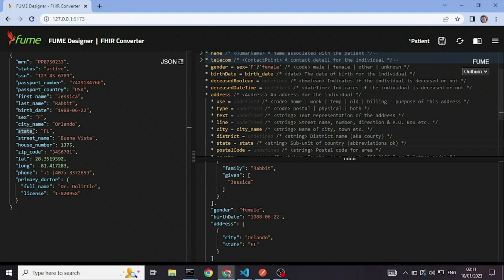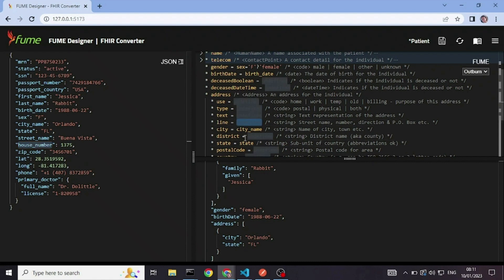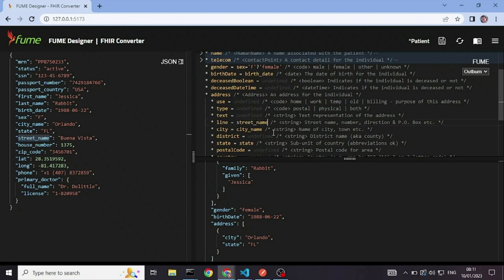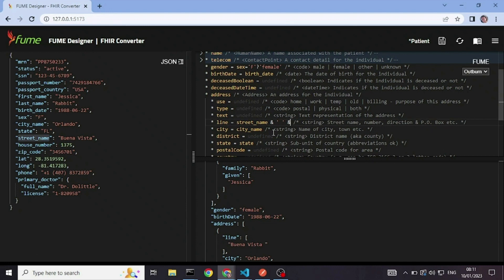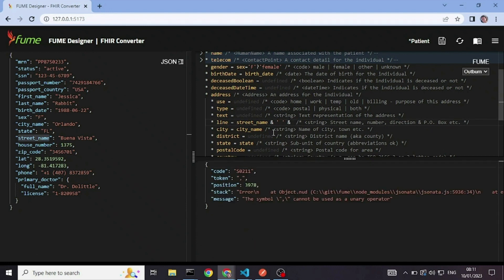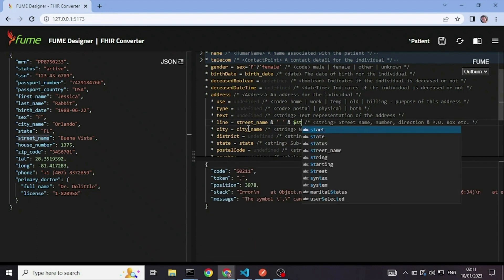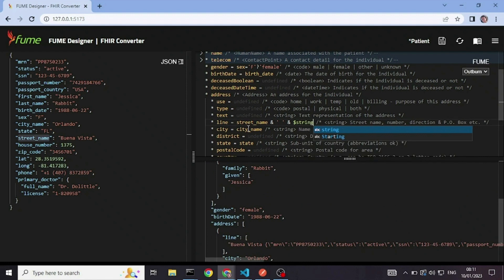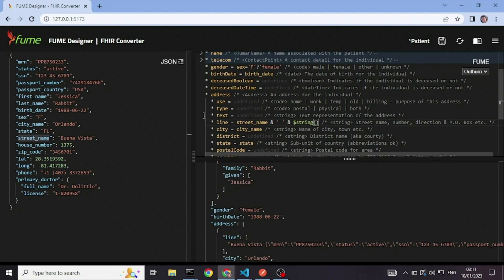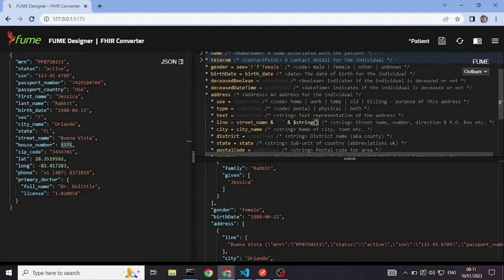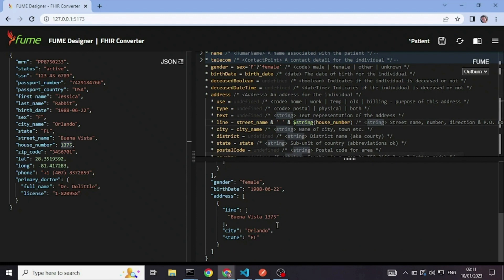What else? Okay, we have a street name and a house number. And in FHIR, we only have lines. So I want to concatenate the street name with a space. And I want to convert the house number to a string. Since as you can see, it's a number here. This is the function that converts anything to a string.